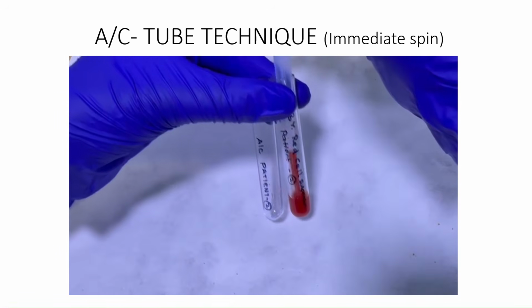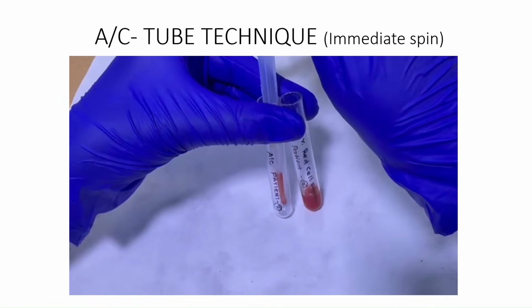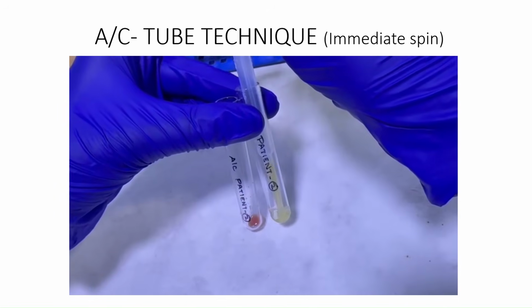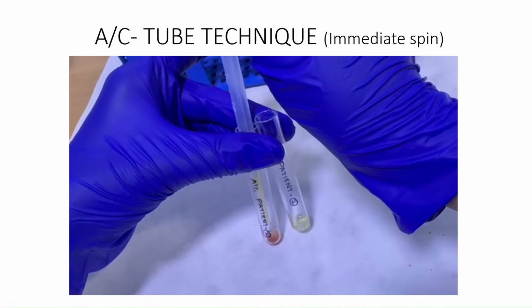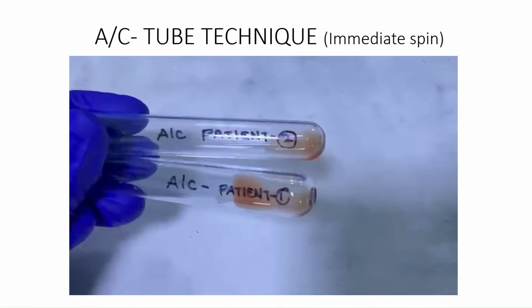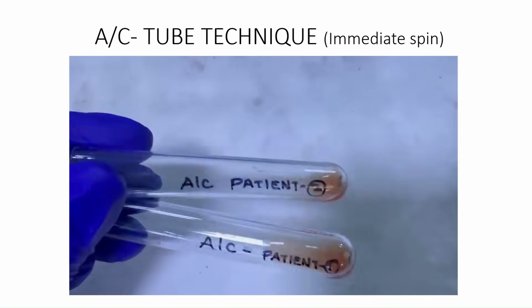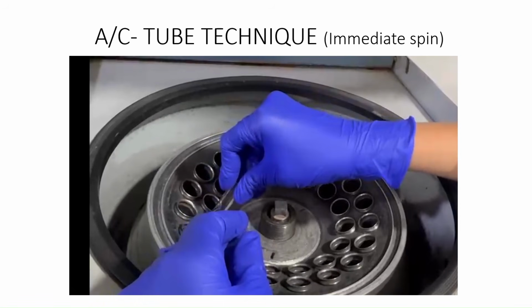Similarly, we are going to do for patient 2, 1 drop of patient red cells and 2 drops of patient serum. Gently mix the contents and centrifuge the tube by properly balancing at 1000 rpm for 1 minute.